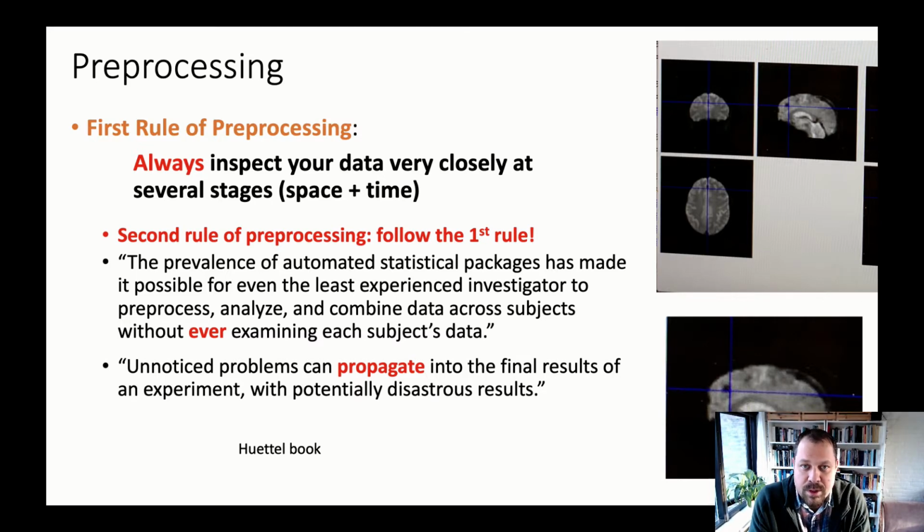Well, probably the most disastrous result is the presence of false positives. So you claim that something is present, although it's not actually there. But it's also equally bad if you end up with false negatives. So something that you should have detected, for instance, in this region. SPM makes a mask based on all the subjects, so this region won't be in your final map.